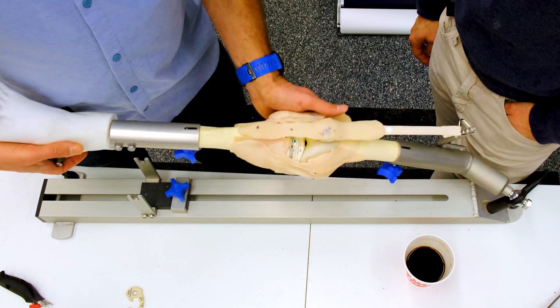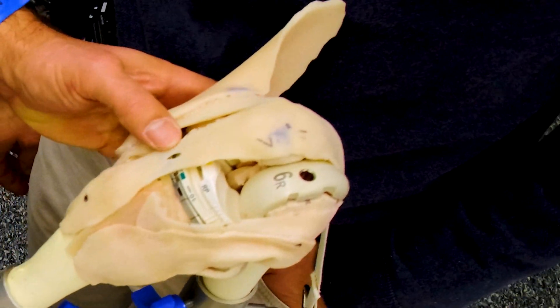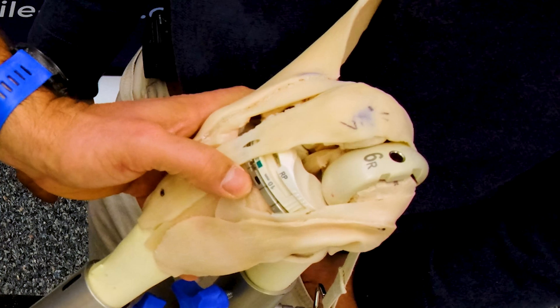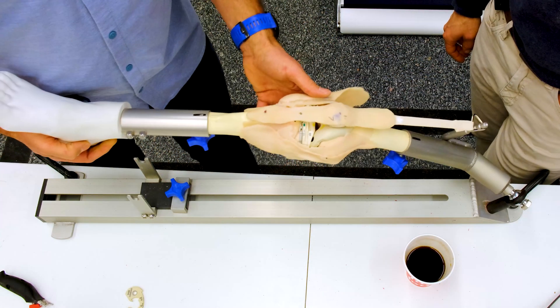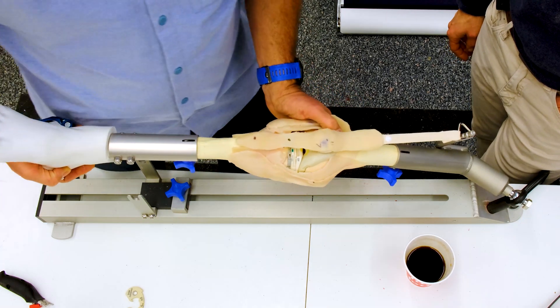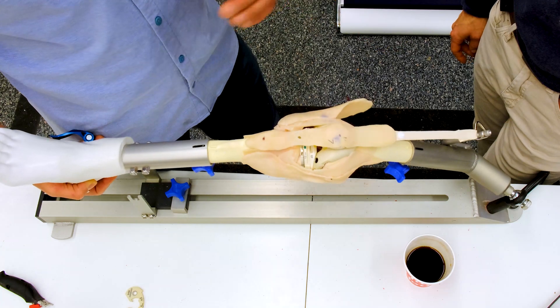Looking at what's happening in the flexion gap, my patella's tracking well and it's flexing, but in deep flexion that tibial tray is coming off and it's translating forward. So tibial lift off in flexion, flexion contracture in extension, tight extension gap and a tight flexion gap. We've got problems with both of our gaps.